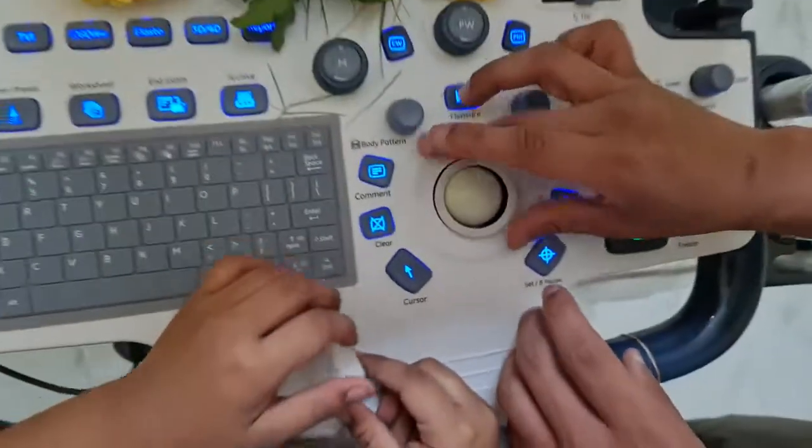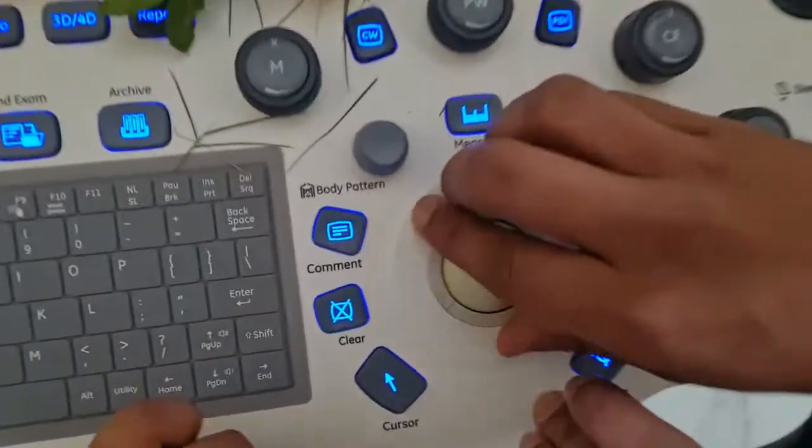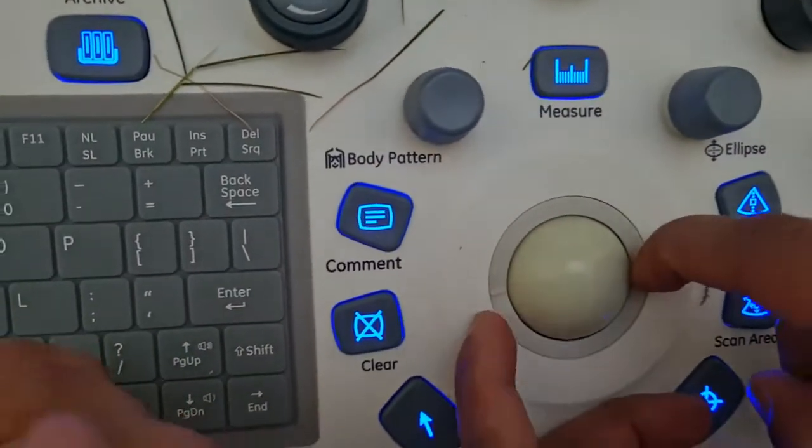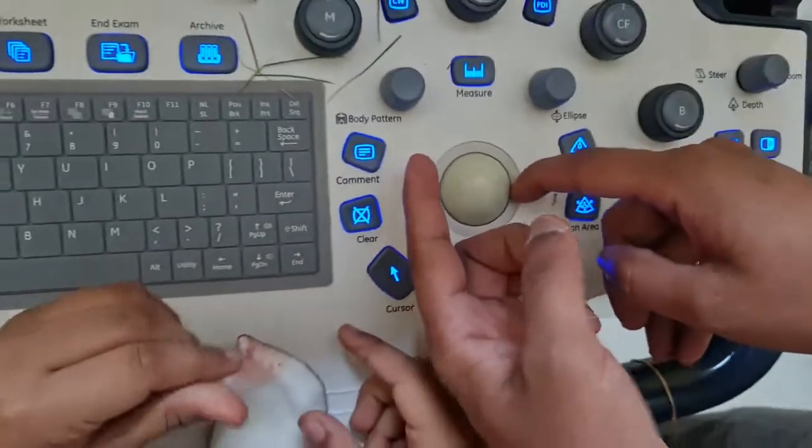And to lock this, just do it in the opposite direction. From the right hand side, you have to pull it downside, and from the left, you have to push it up.